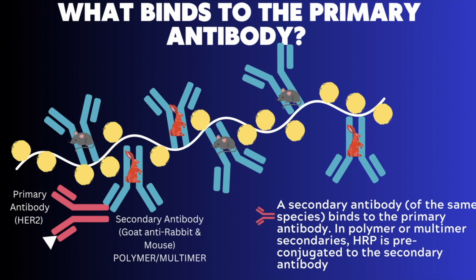Back to the secondary antibody used here on the screen. This long area represents a conjugated antibody. This long white ribbon represents a dextran backbone. And onto that backbone, antibodies from two different species are attached. Half of them are mouse antibodies and the other half are rabbit. The yellow circles represent HRP, which are also conjugated to this white backbone.